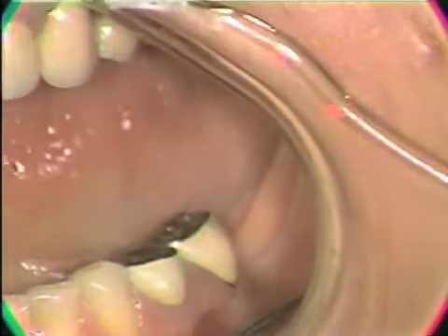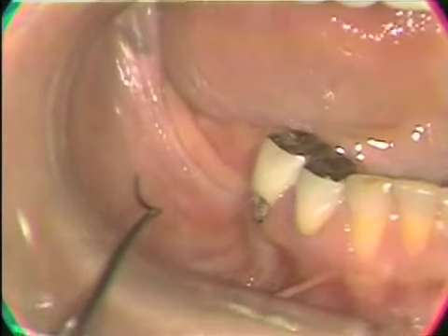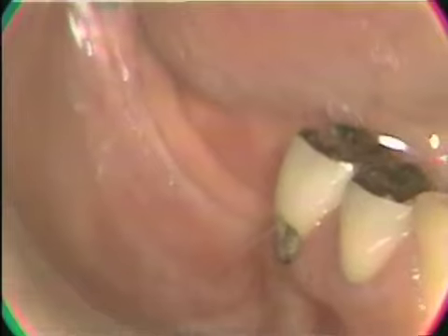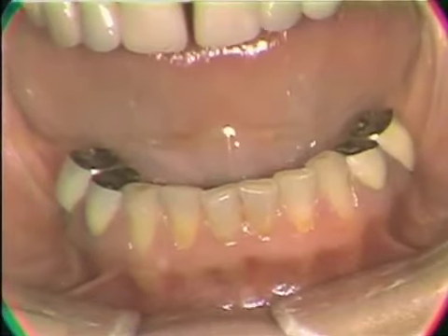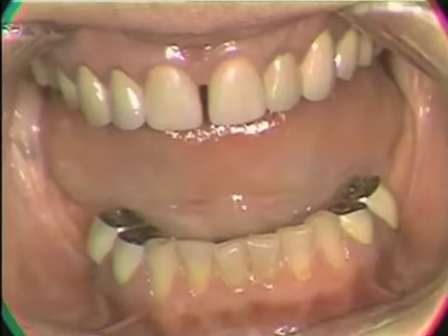Would you roll your head this way a little bit? Make sure that there's no injury to the tissue, no inflammation to any of the ridge tissues or peripheral tissues. Would you roll your head that way, please? This is a difficult ridge to work with. We have very little ridge there. The tissue attachment of the peripheral tissues is way up on the ridge, and we can wind up with a very distorted impression here. So the first step in preparing the mouth for the impression would be to leave the old appliance out and allow the tissue to come back to as normal a condition as we can.